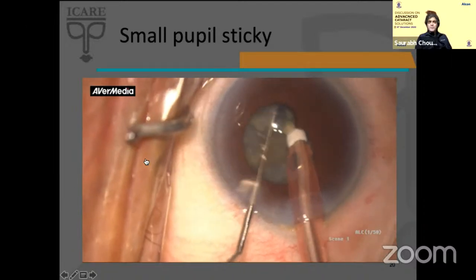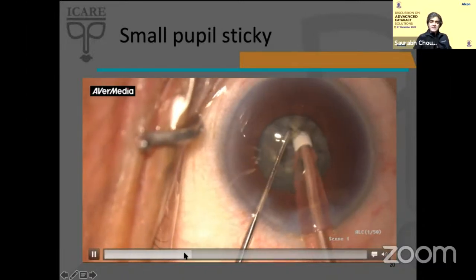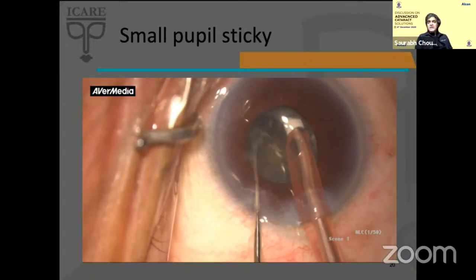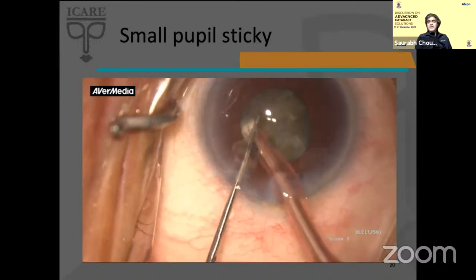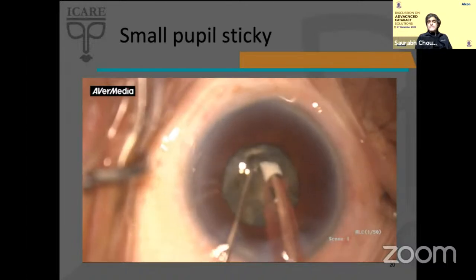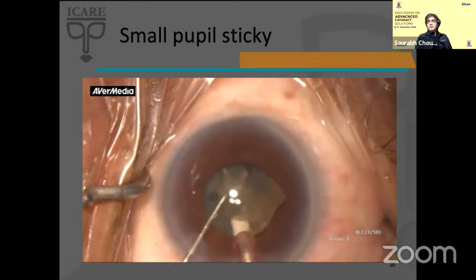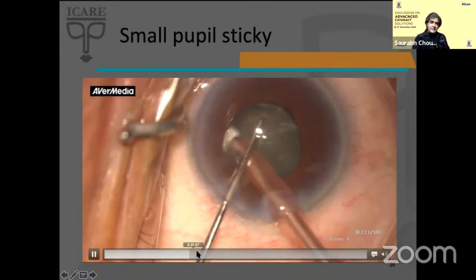And as it's a small pupil, here I was just trying to show that I have actually caught hold of the iris also. So I'll just try to go back slightly, and let's see here as I am going ahead, I am chopping here, and that's the next chop here, and if you see here, while doing this maneuver, so that's the chop which is coming through. I'm now removing this cortex, and I back slightly.